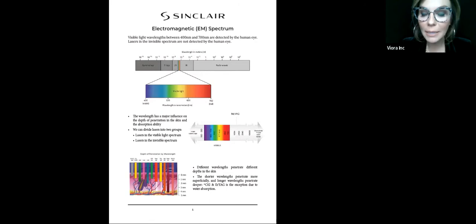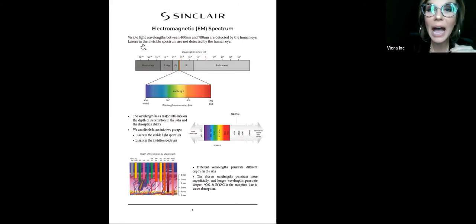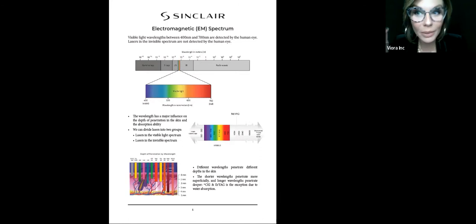There's one exception to that rule, and that is when we're dealing with CO2 or erbium YAG lasers. The reason for this is CO2 and erbium YAG lasers are much longer wavelengths, in the 10,000s, well, the CO2 is. And when you get that long of a wavelength, when you look at the chromophore absorption chart, water is a big chromophore. Chromophore is a light sensitive molecule. It wants to attract that light. So water, the longer the wavelength, the higher absorption ability. So when you get into these really, really high wavelengths, you get a really high attraction of water.